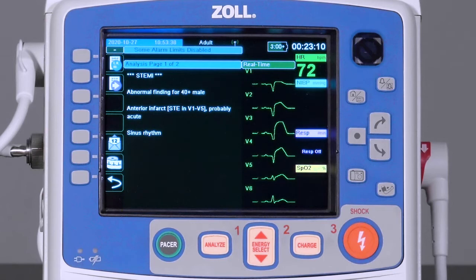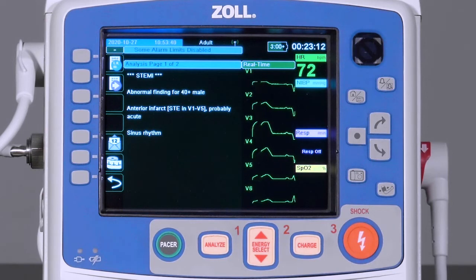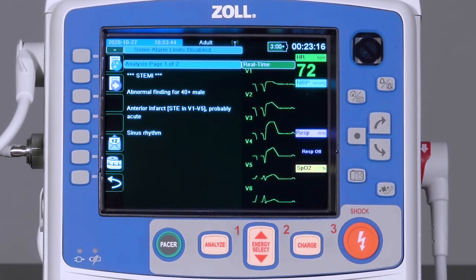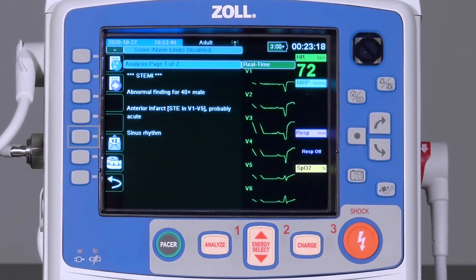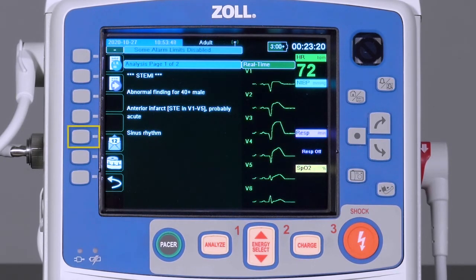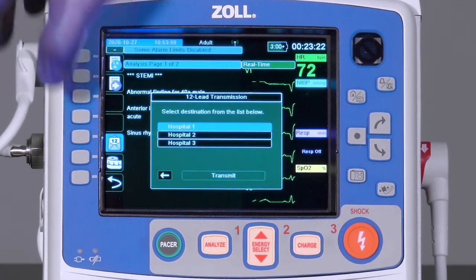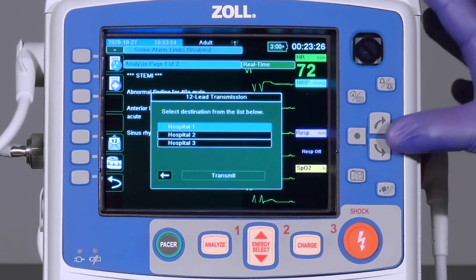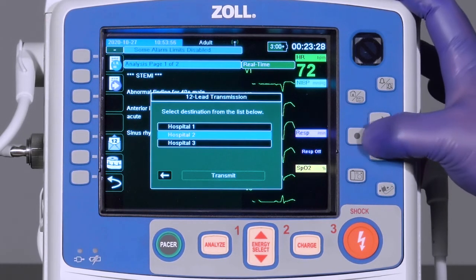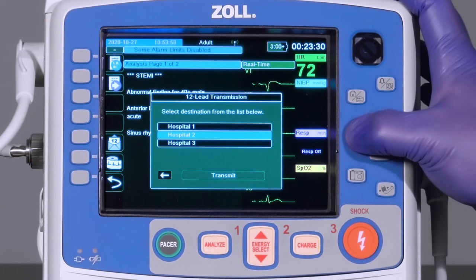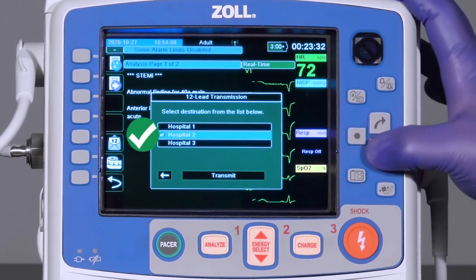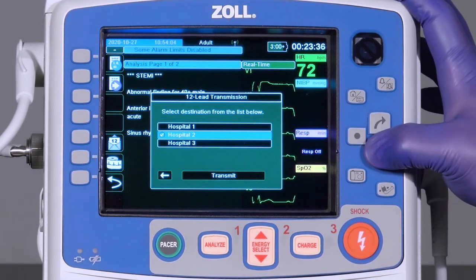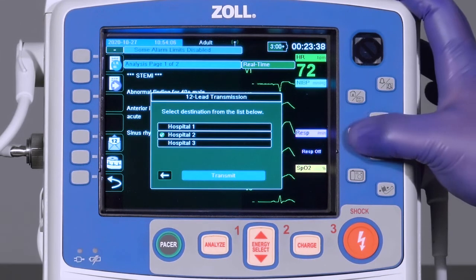The 12-lead ECG can be transmitted to a facility using pre-configured Wi-Fi, Bluetooth, or cellular connections. Press the Transmit key to access a list of available distribution points. Use the navigation keys to select the desired destination and then confirm by pressing the Select button. A green check mark will appear next to the selected facility. Scroll to the Transmit option and press Select.